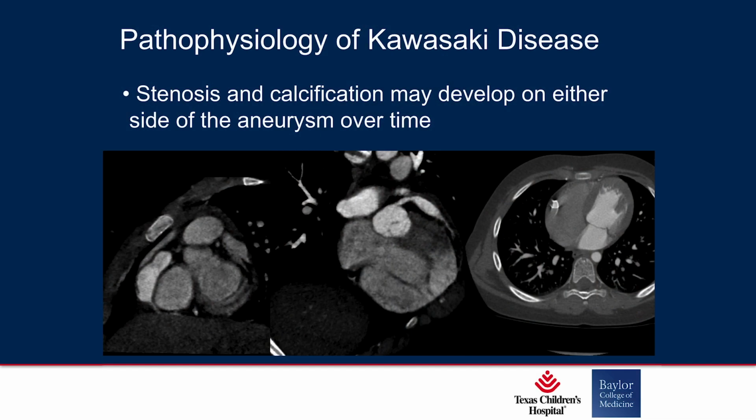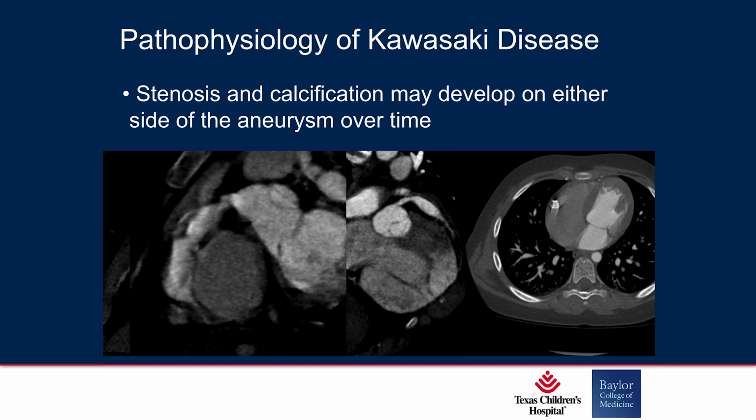Kawasaki disease, I heard that that's one of the pathophysiologies that's maybe most akin to adult coronary artery disease. And I would agree with that to some extent in some cases. You can see here in this bottom left, this is the coronary artery. Obviously, in this case, there are giant aneurysms where you're concerned on either side of the aneurysm for perianeurysm stenosis. This is an image here just showing the artifact of the aneurysm formation. And then in this patient here, this is the same patient, this is actually a follow-up scan where they've now had thrombus formation. And I would propose that in these patients where you're having thrombus formation that may be unstable, that may be one of the tougher pathophysiologies to predict the likelihood of events, just because I don't think that's going to have the same progression as you would with atherosclerotic coronary artery disease or simply just a fixed obstruction.